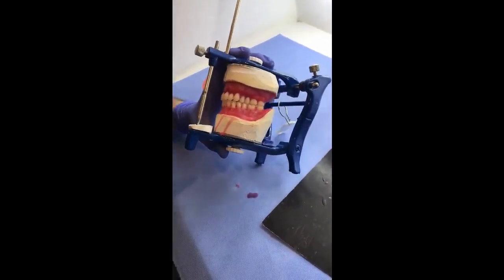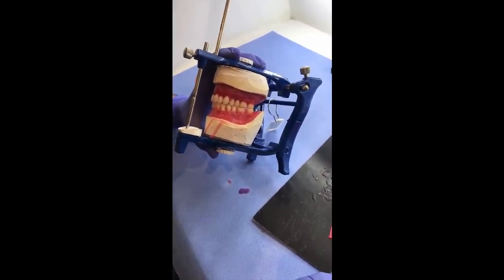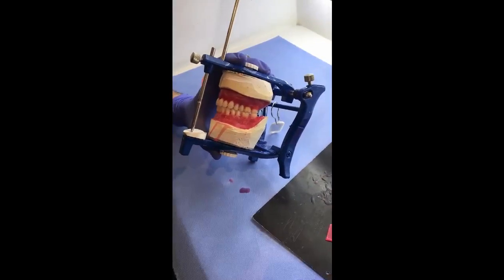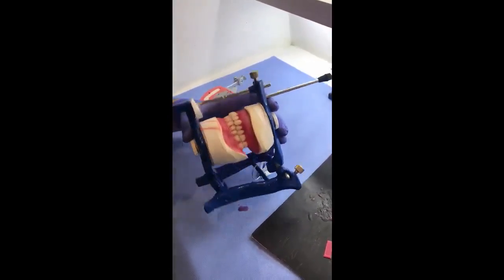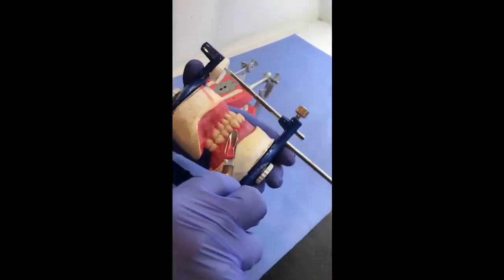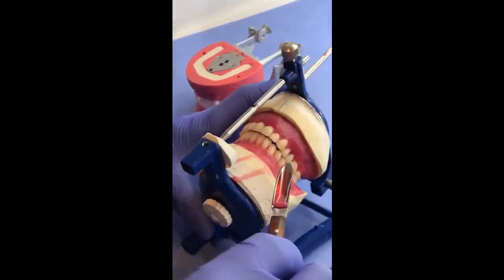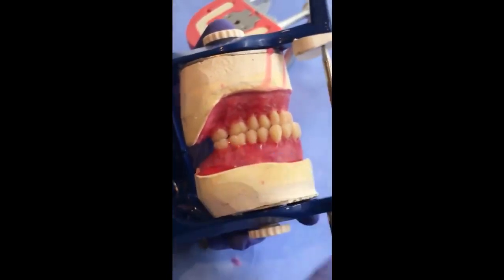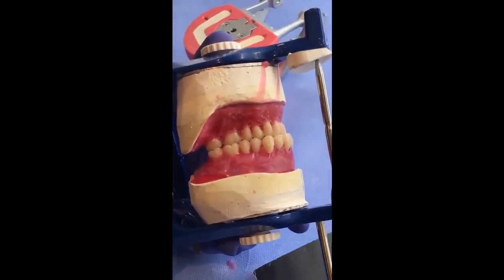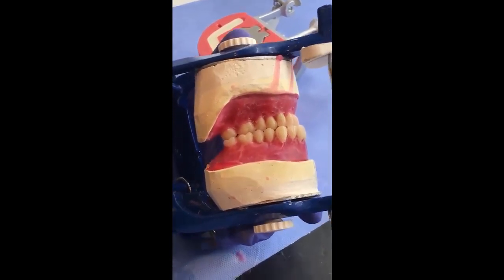Now, the first step in achieving the proper waxing up and festooning is by adding wax. We need to add a sufficient bulk of base plate wax to the denture base, which can then be carved to the proper contour. Now, the technique we are going to use is the drop-in wax. You can notice here I have melted wax. I'm going to add it while holding the articulator in the centric relation. So this will prevent the teeth from movement and changing the articulation between the teeth.